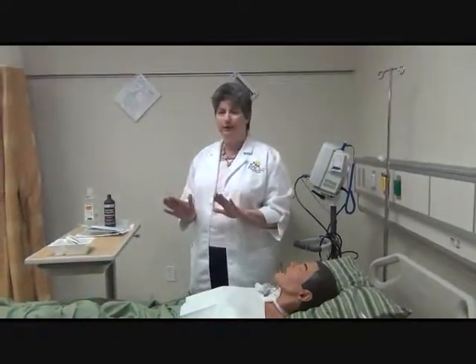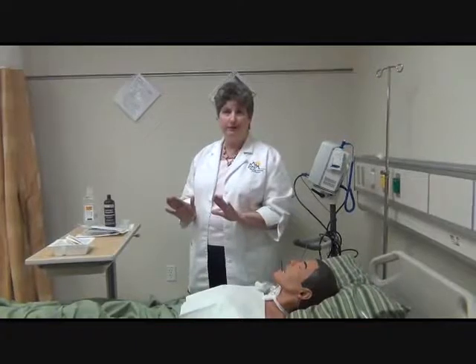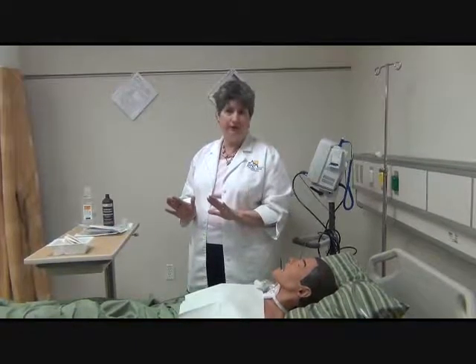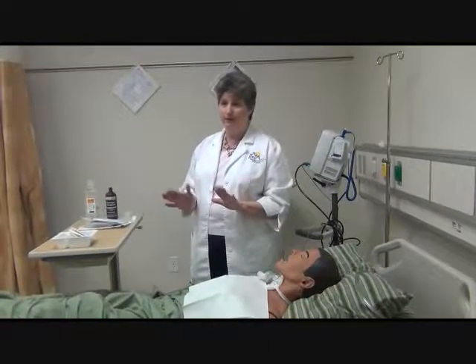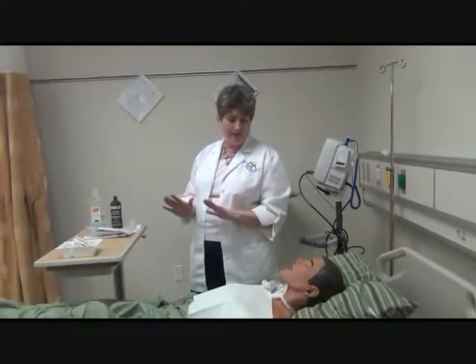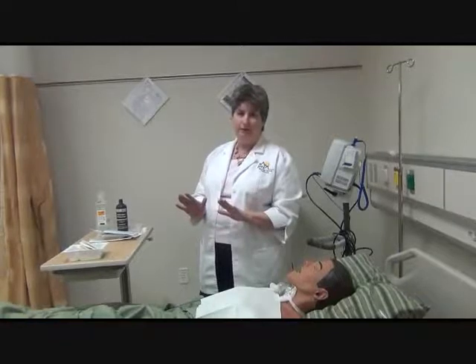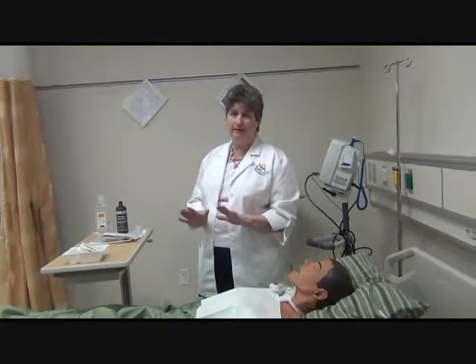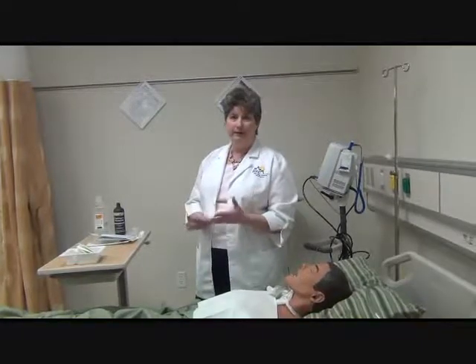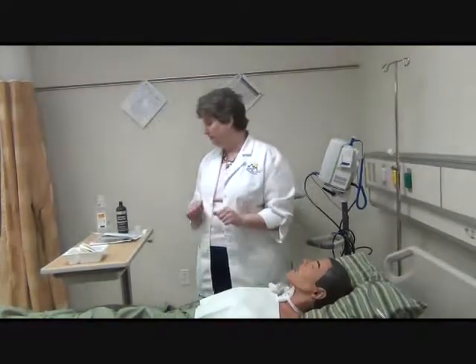Now, locally, in some of the facilities, the respiratory therapists are going to be responsible for trach care, but if you're out in homes, this is your job. You're going to be responsible for having to help maintain these. You're going to do this on a PRN basis and or a scheduled basis, and again, that'll depend upon the needs of the patient and the facility that you're at.